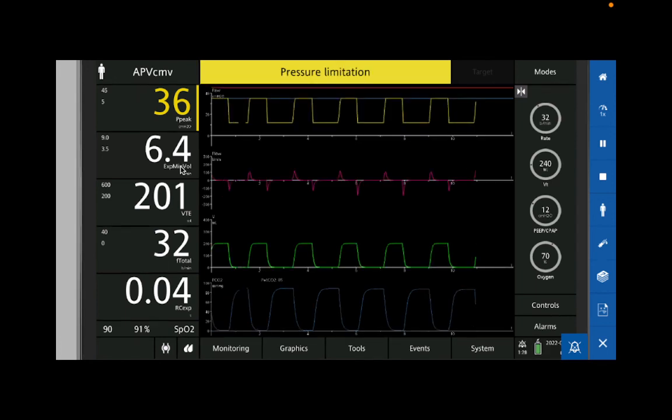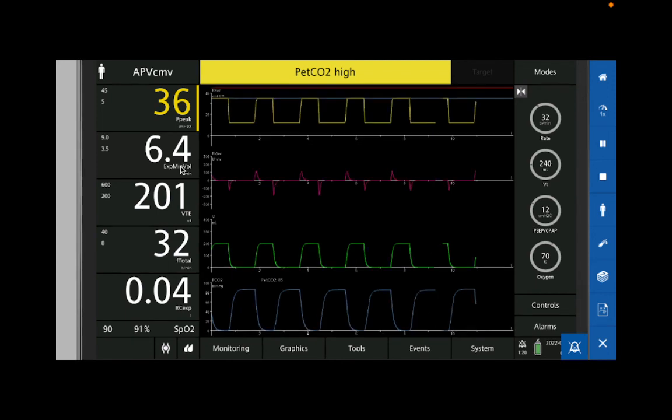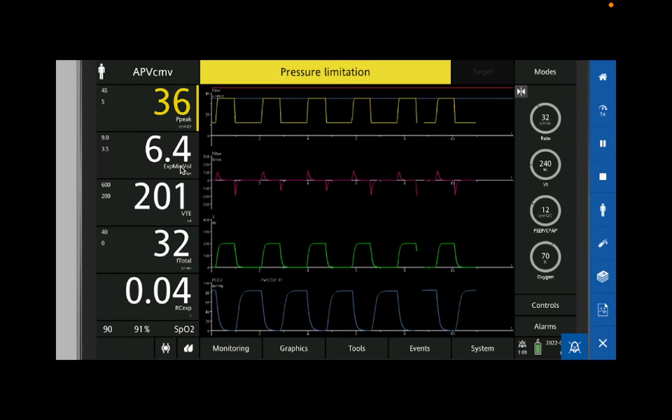As the patient exhales, you want them to exhale all the way back to the baseline, okay? And then the next breath's going to start, okay? What if as a person is exhaling, they haven't reached baseline yet, and we start a breath? You're going to see it cut off and go straight up. Does that make sense?